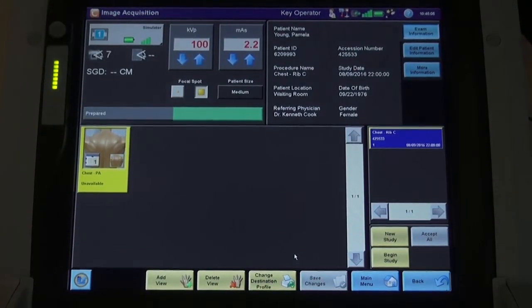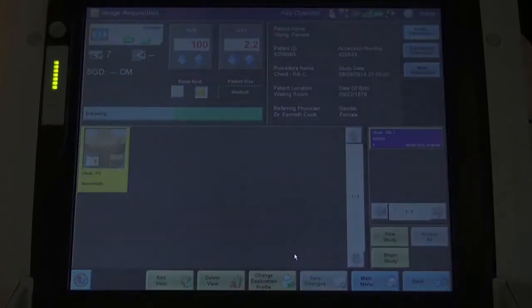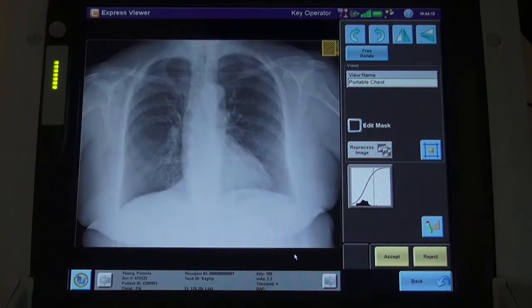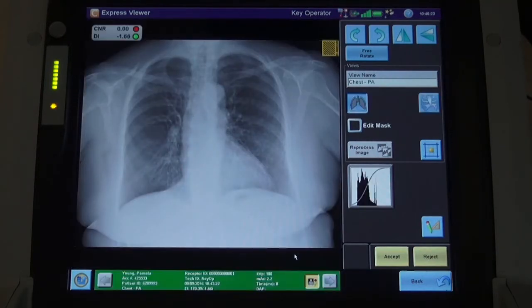The preview image of the chest appears within 3 to 5 seconds. Once the full resolution image is available, the radiographer selects the bone suppression icon in the view pane.